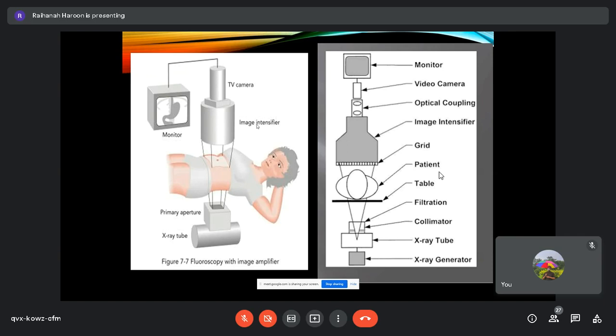She was asking this radiographer to do an X-ray, but she was treating it like a fluoroscopy machine. She asked the radiographer to capture, not screen, 17 times of chest X-ray to locate the nasogastric tube, which is absent. It should not happen, but she thinks it can be done that way. She thinks that a portable X-ray machine is equivalent to a fluoroscopy machine.